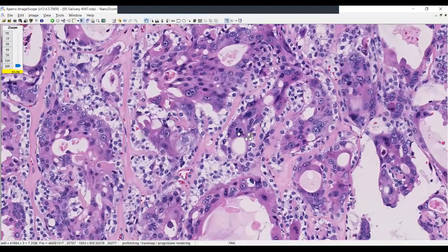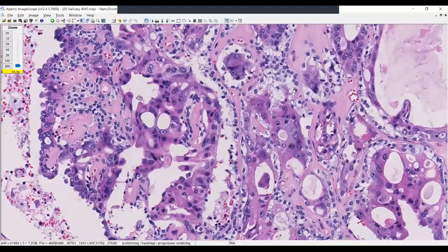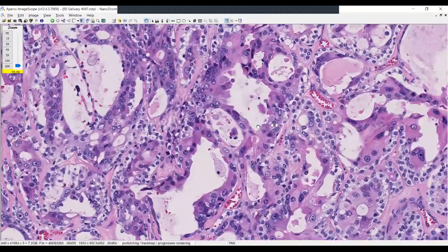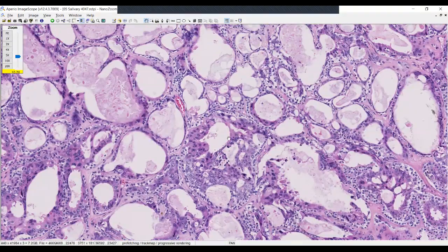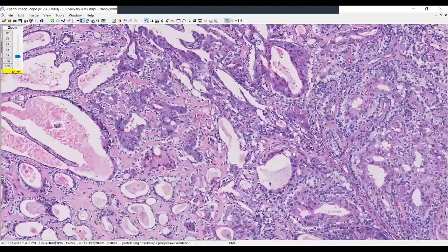There is profound nuclear pleomorphism along with remarkable increase of mitotic figures, including atypical forms, as you can see in this example. And so whenever I have a tumor like this that has transformed, I usually do 2 markers in this case. The first one would be an androgen receptor, because I would like to be able to confirm that it is apocrine and salivary duct carcinoma, since you can use androgen deprivation therapy for the lesion, as well as getting a P53, since many times the mutation of P53 or overexpression of P53 can certainly be seen.